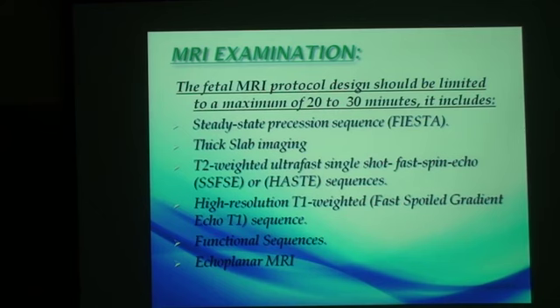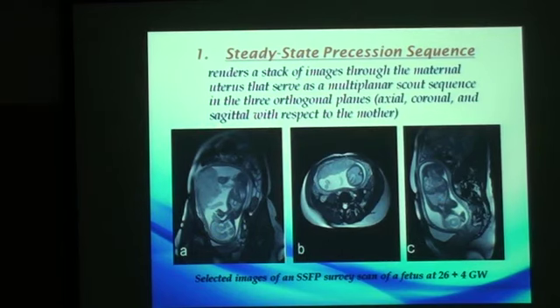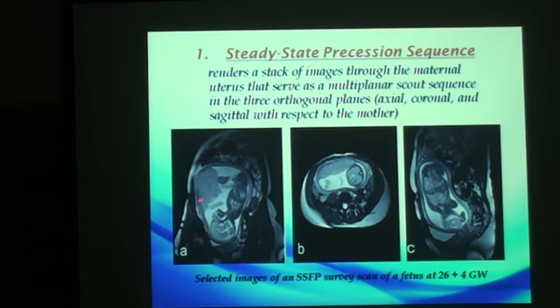The steady-state precession sequence is the scout sequence we use. It renders a stack of images through the maternal uterus in different planes, providing multiplanar images in sagittal, axial, and coronal views. It has a slice thickness of 6 to 8 millimeters with a 1 to 2 millimeter gap. CSF gives a hyperintense signal, which delineates the anatomical features of the fetus as we see here.